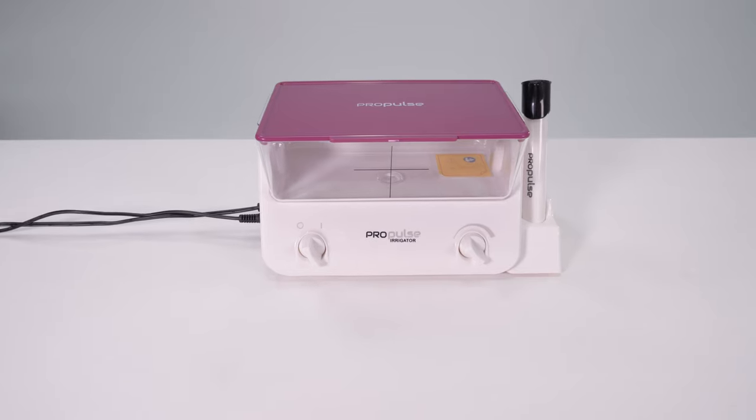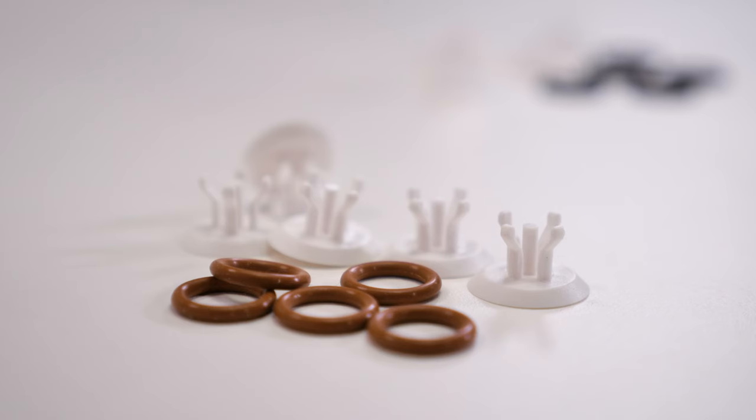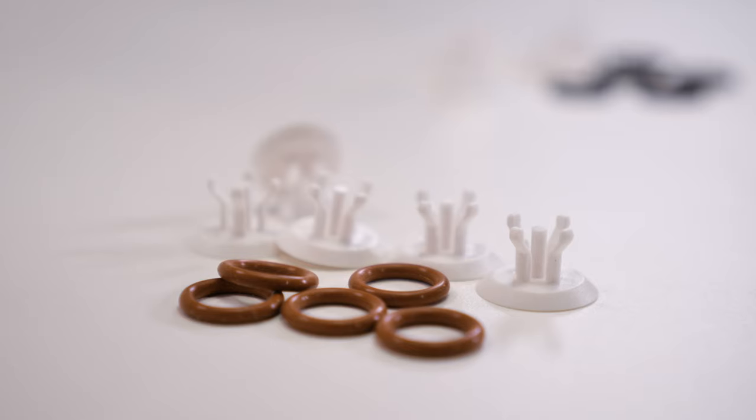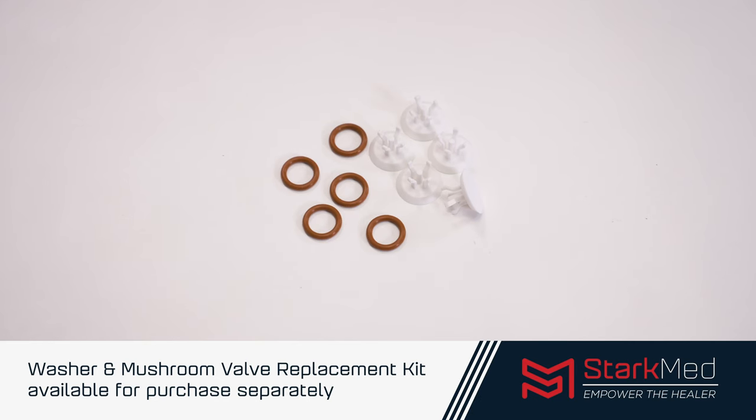The current PP17 purple lid units and the previous G5 black lid units use the orange washer and mushroom valve kit. These can be purchased separately in a five-piece replacement pack.